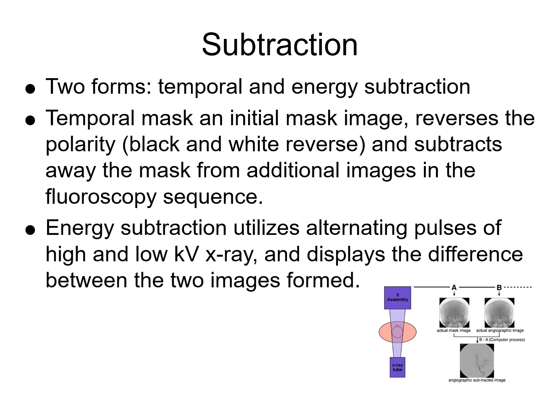The more modern software version of energy subtraction, and this is really neat, it borrows from bone densitometry. So in bone densitometry, to isolate bone tissue, bone attenuates pretty well regardless of whether it's high or low X-ray energy, high or low kVp. It attenuates pretty well, okay? But soft tissue does not. Contrast agents also attenuate pretty well regardless of whether it's high or low energy X-ray.